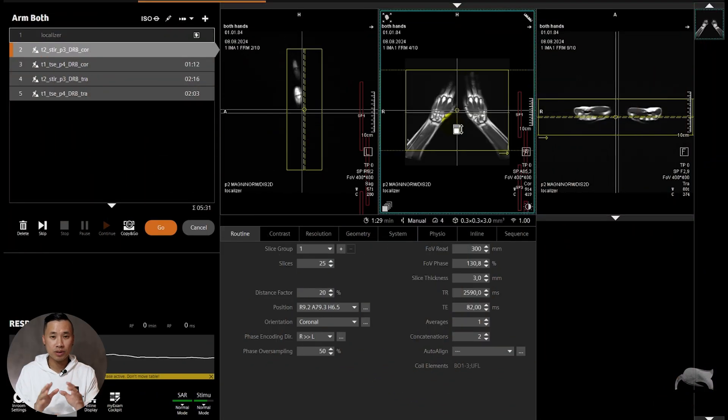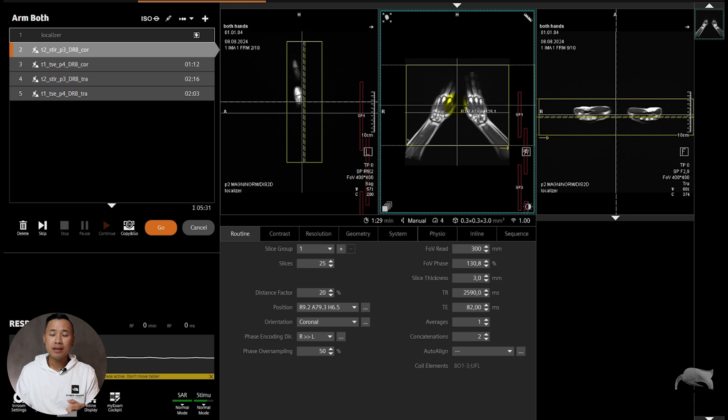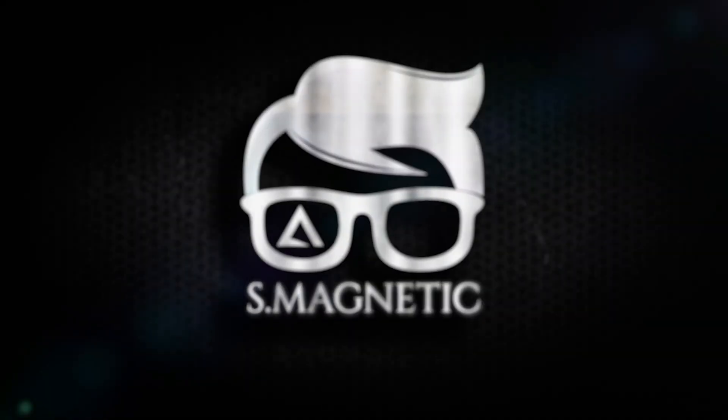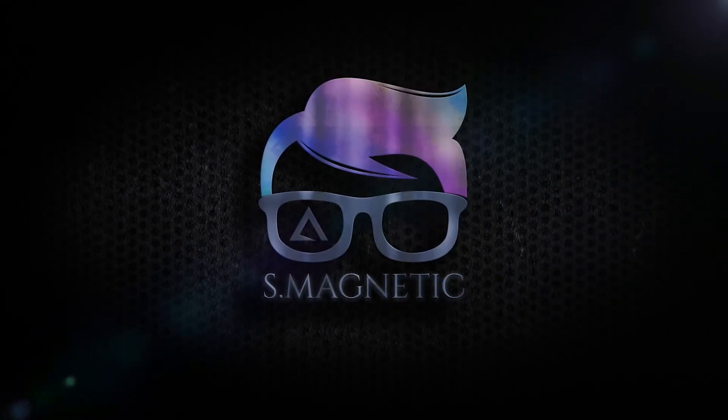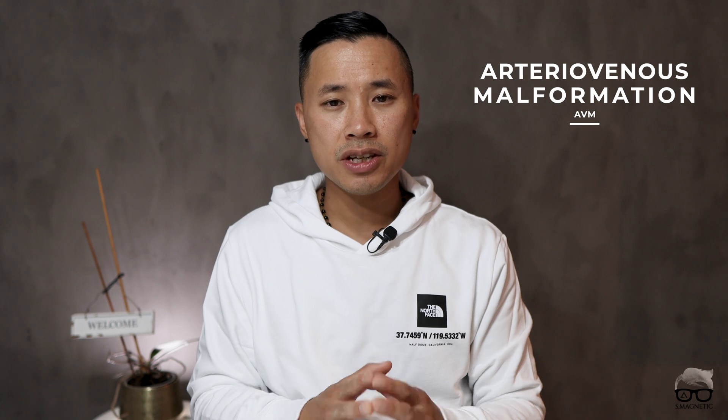We had to scan both hands all together. For those who don't know, my name is Bak — I'm an MRI radiographer, and I cover topics from basic to advanced MRI tutorials just like this one. So, we usually scan one hand at a time, but this case was special because we're talking about arteriovenous malformation — AVM. This patient had AVM on both hands, so we needed to highlight both hands.